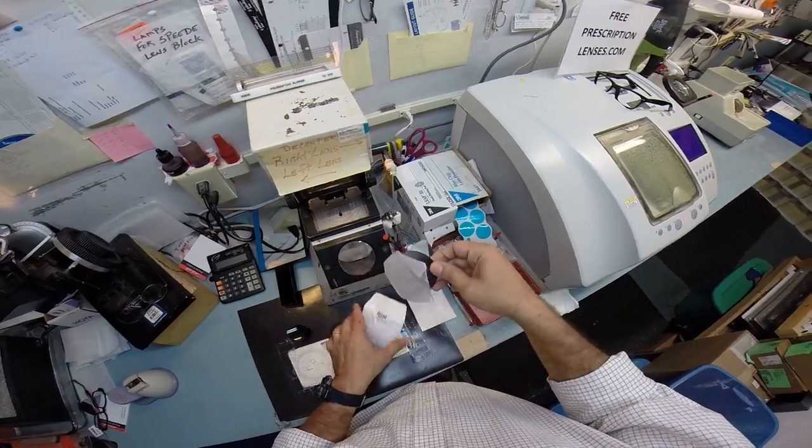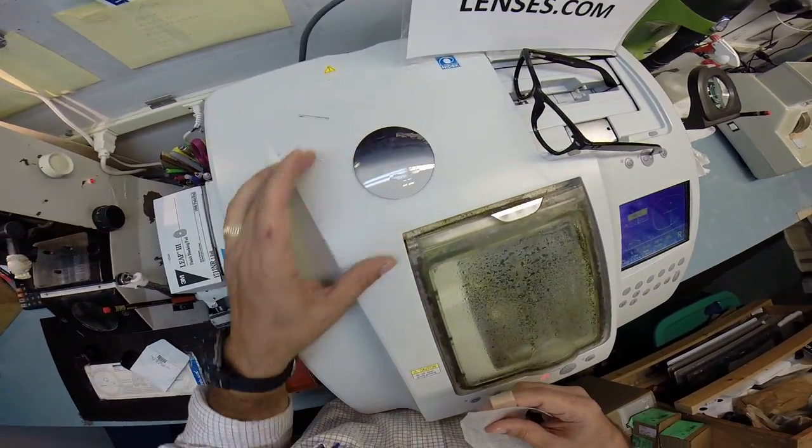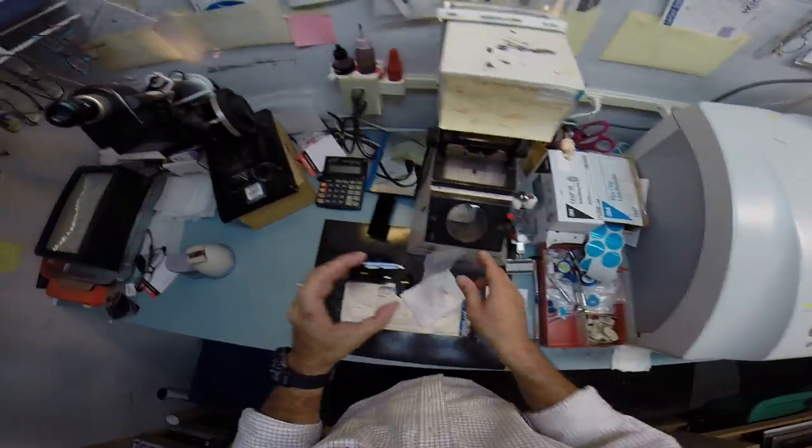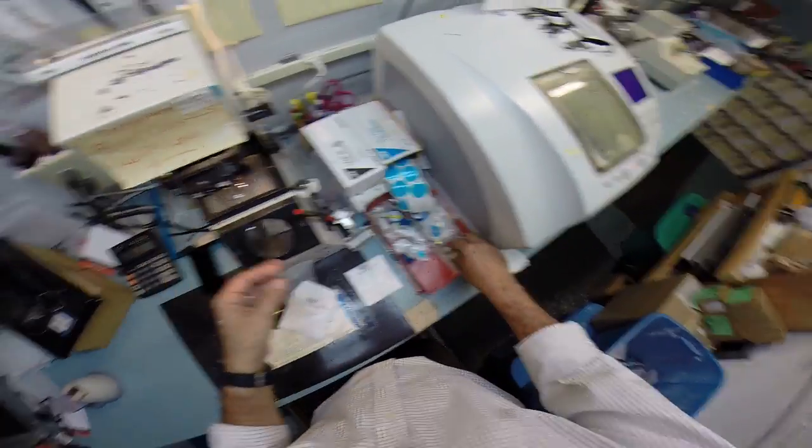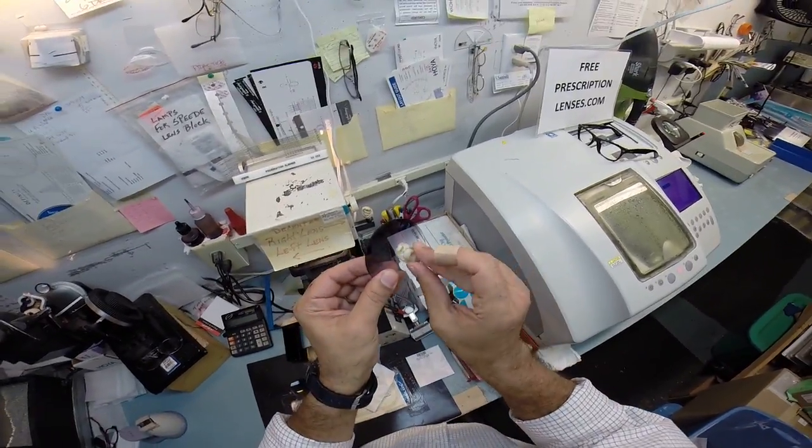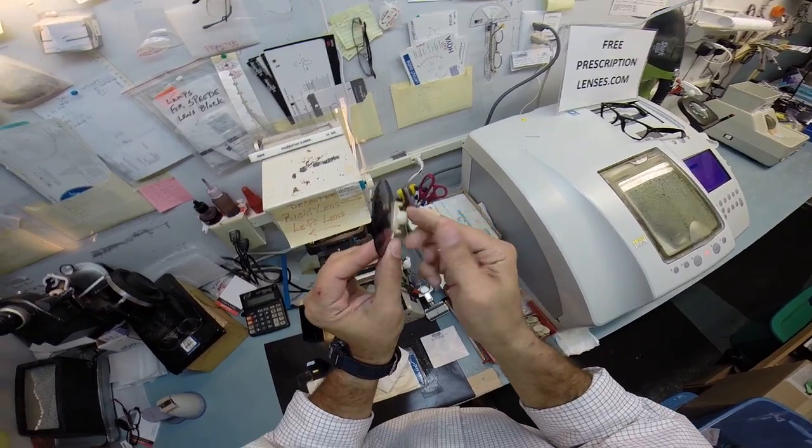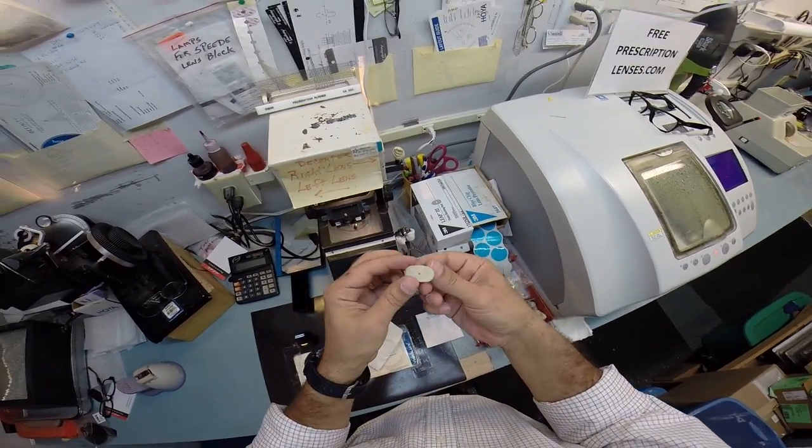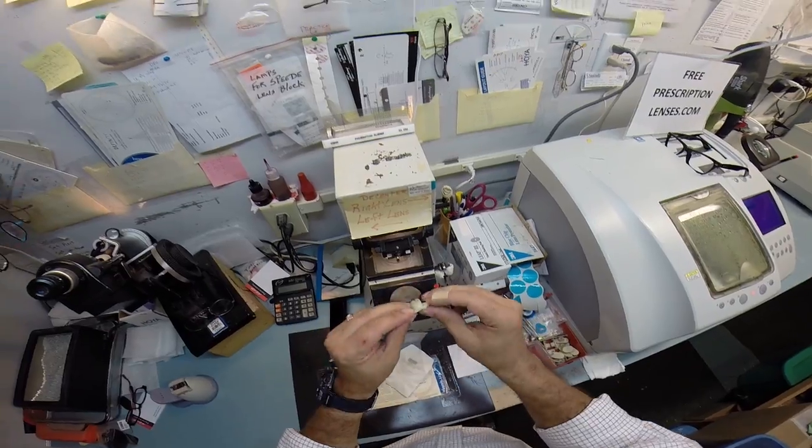These are your lenses. This is your right lens. The gradient lens that's going to go in there and the bottom is going to be clear where your bifocal is at. I'm going to put the lens there. This is a block. This is what I need to attach to your lens in order to cut it while it stays in the machine.